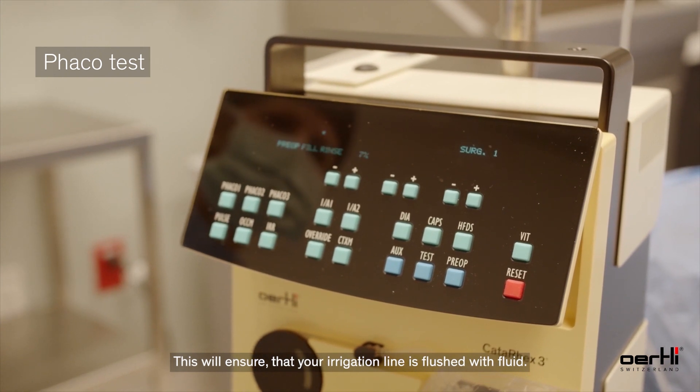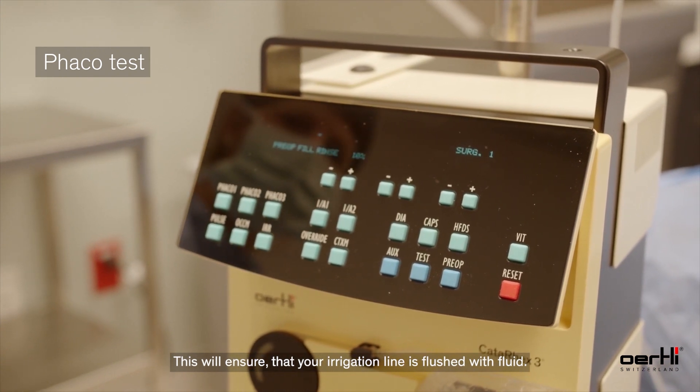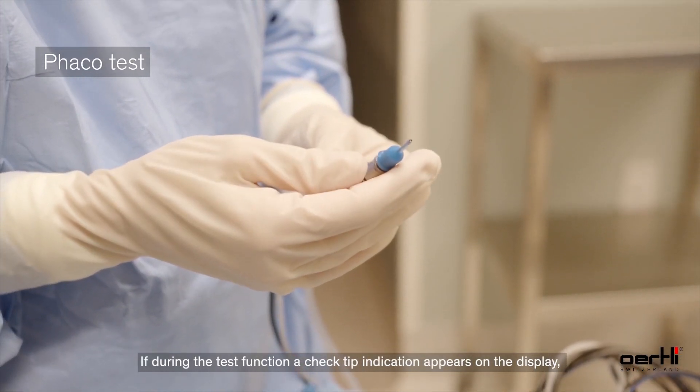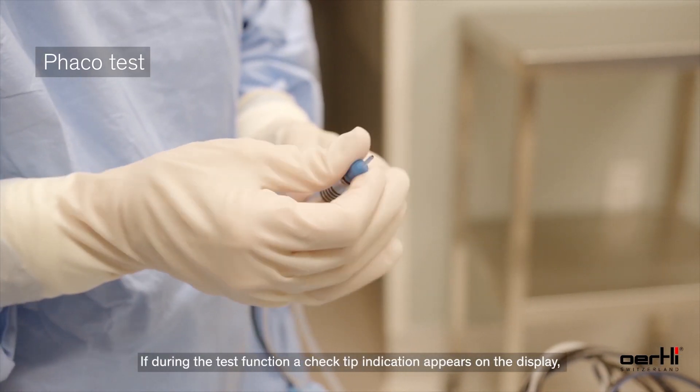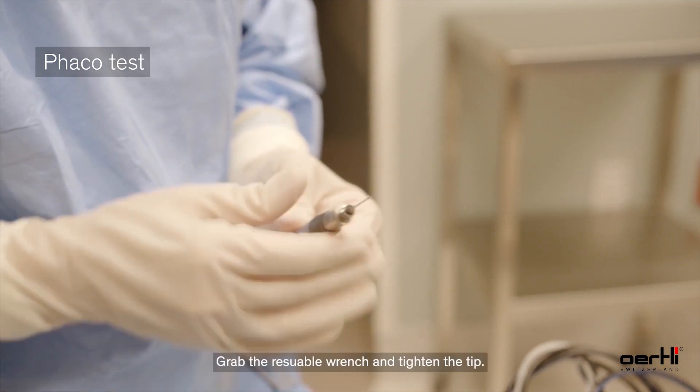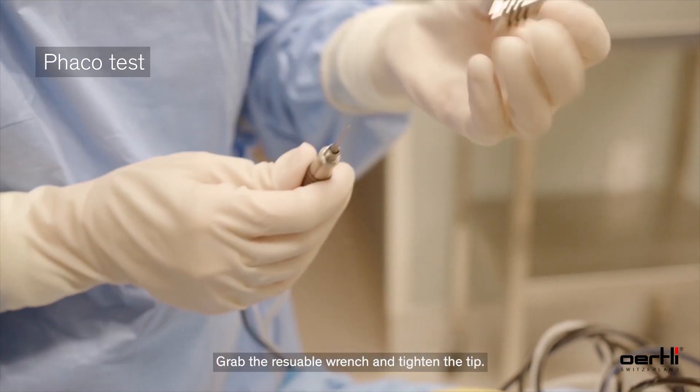Select the pre-op button to ensure that your irrigation line is flushed with fluid. The system will then be ready for use. If during the test function a check tip indication appears on the display, simply remove the sleeve, grab the reusable wrench, and tighten the tip.